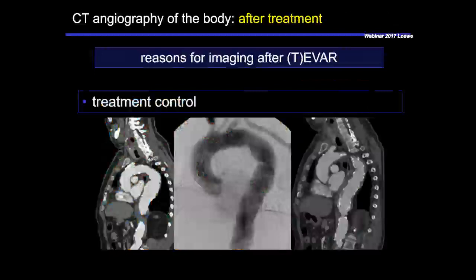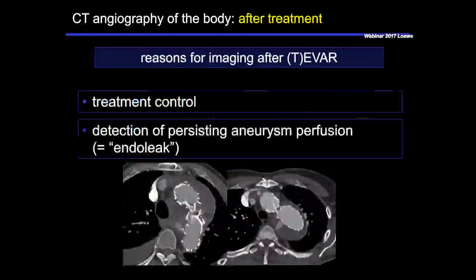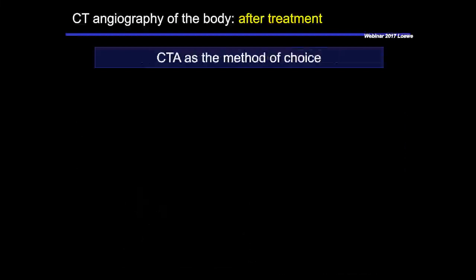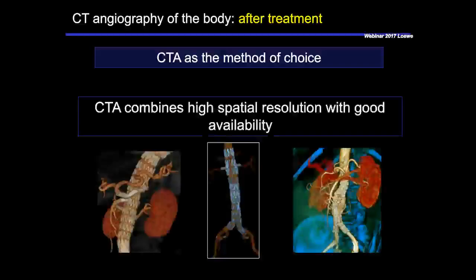And of course, when we're talking about endovascular aortic repair, we can directly assess the persisting aneurysm perfusion, the so-called endoleaks, after unsuccessful exclusion of the aortic aneurysm. And we can also use the CT as a planning tool for the upcoming treatment of a possible complication. So CTA has become the method of choice not only as a planning tool, but even as the follow-up tool, because it combines high spatial resolution with very good and almost everywhere availability.